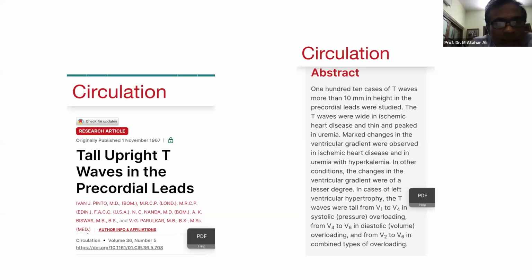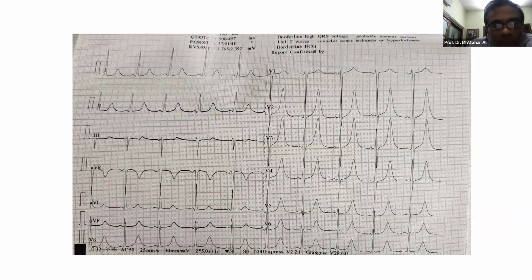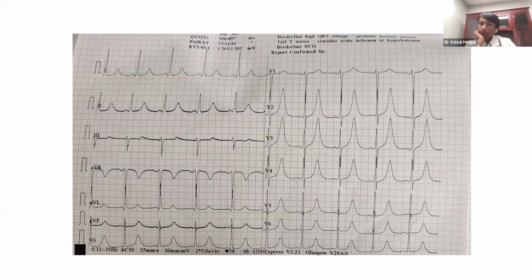Shafique, can you go back to the ECG again? Aziz bhai, actually, this is a tall peaked T wave with wide base, and both the limbs are almost symmetrical, though the ECG satisfies the criteria of an ischemic T. Right, sir. So hyperkalemia is excluded because of the wide base and symmetrical limbs. But the possibility is that it is ischemia related, not necessarily an ST elevation MI.